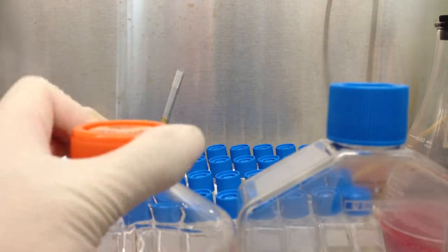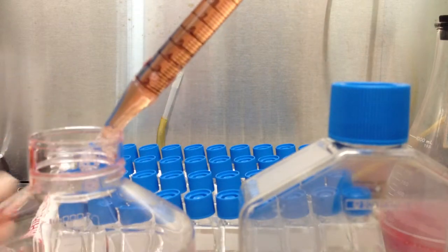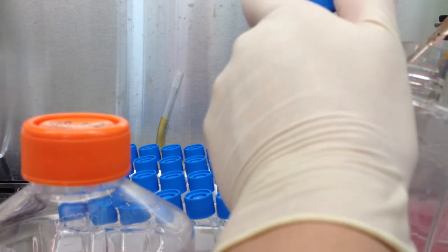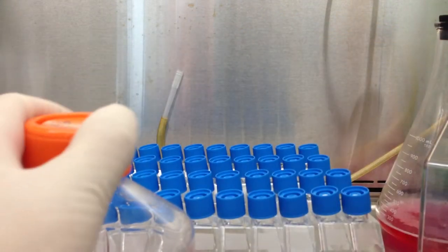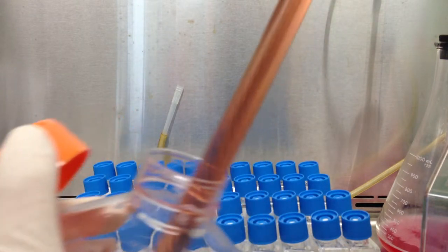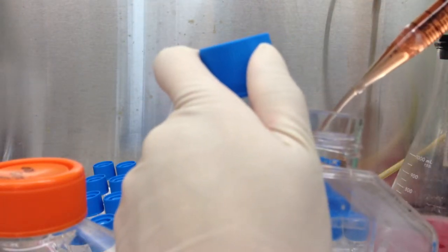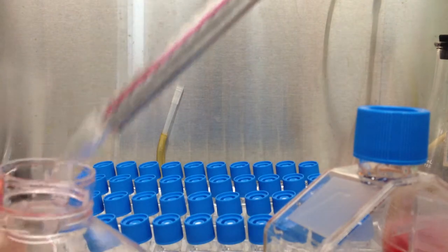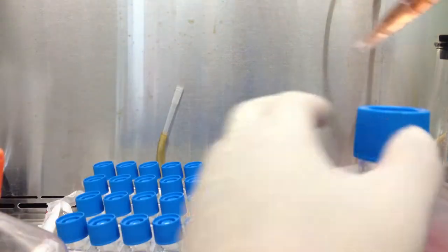I'm just unscrewing the cap right now. You can use the same pipette tip to put D10 media into the flask. Just make sure that you don't touch anything with the tip. And I don't think I can show this. I'll try to raise the hood a little to adjust my camera. You're going to try your best to not touch the tip to anything. If you do, I mean, it's no big loss. You can just use a different pipette tip.